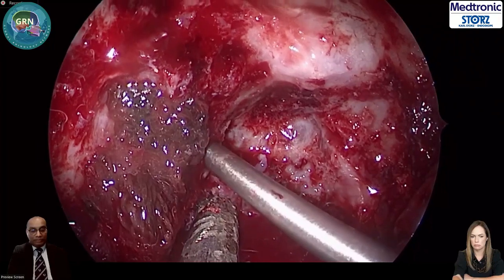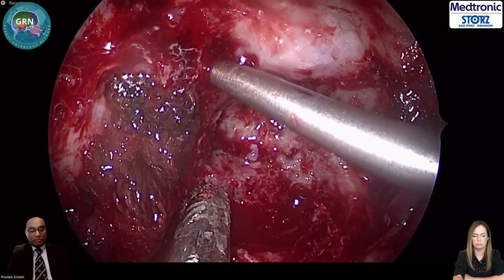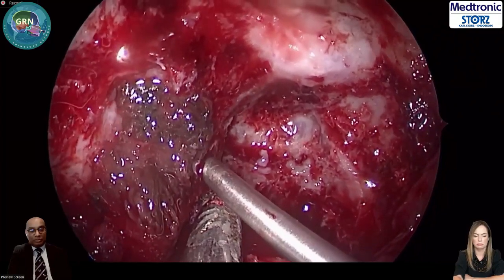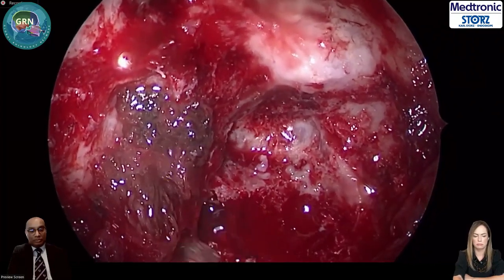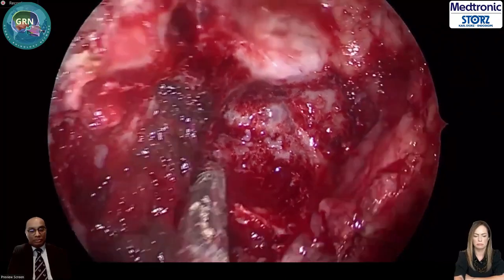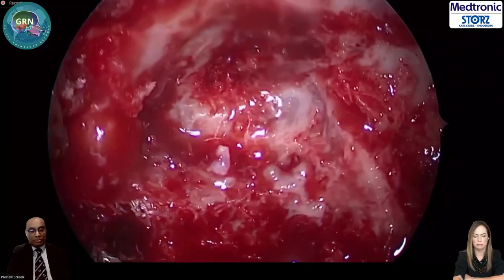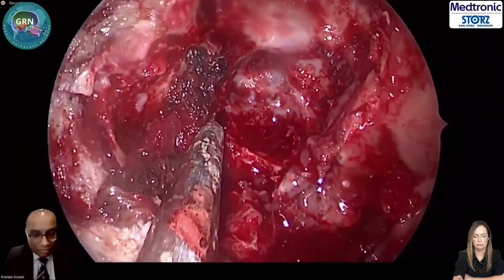That's carotid, carotid, carotid, carotid. Now, Dr. Monica will send it to you, how we have traced the complete carotid. Give me a Surgicel. Okay. That's paraclival carotid. No, I can't do anything there. That's the last thing I can do.